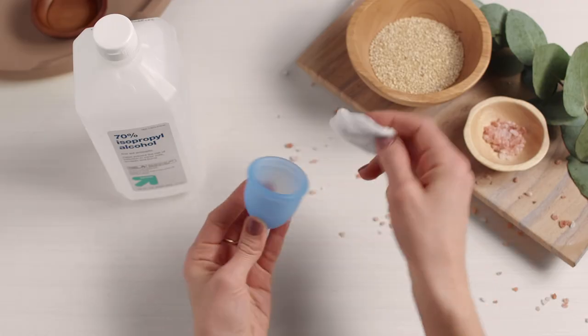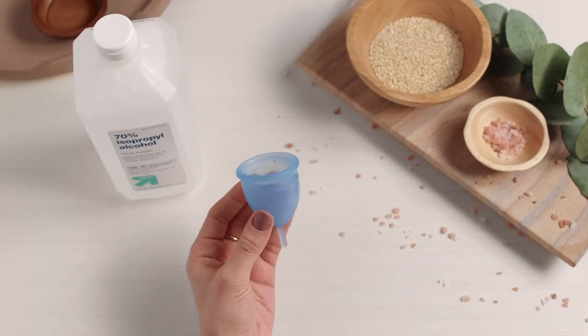Another option for sanitizing your cup is to wipe it down with a soft rag and 70% isopropyl alcohol. Be sure to let it air dry before storing.